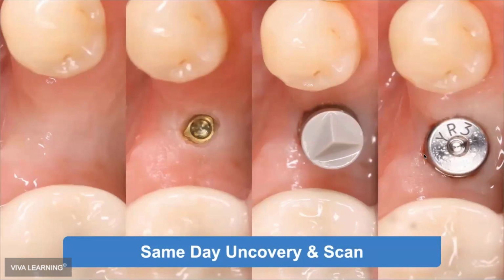I oftentimes go ahead and make the same day screw retain crown depending on how well the implant is placed. So, if you're going to see the patient back in a couple days or a couple weeks, then go ahead and place your healing abutment. But if you're going to deliver it, just leave it exposed like it is. You can always hit it with the laser again in an hour if the tissue collapses a little more, and go ahead and place your implant.